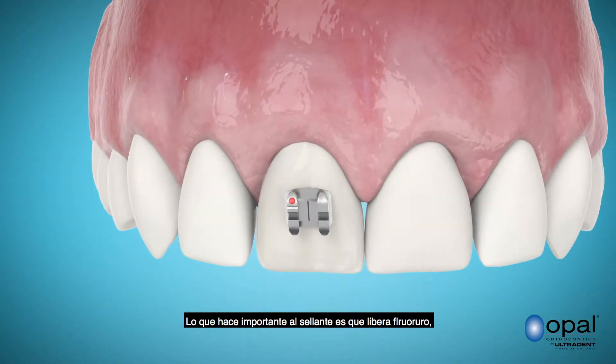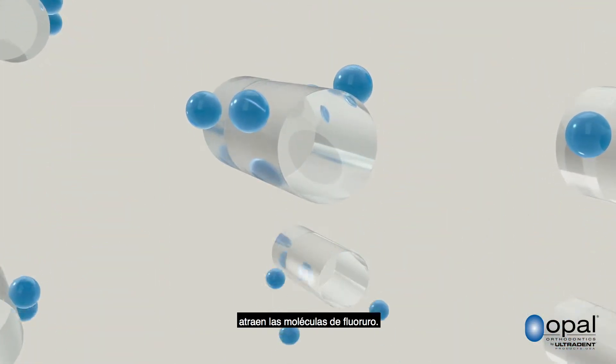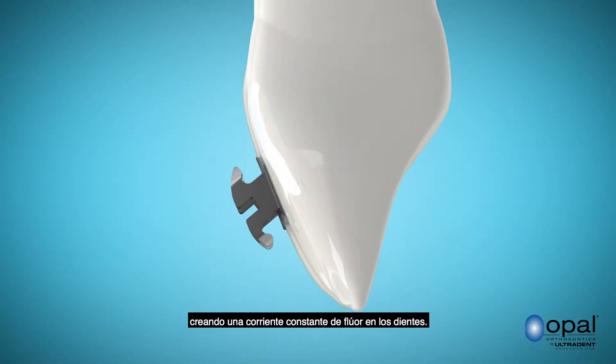What makes a sealant so important is it releases fluoride, which promotes oral health. Microscopic glass ionomer particles in the sealant attract fluoride molecules. The fluoride molecules are then slowly released from the sealant, creating a steady stream of fluoride into your teeth.